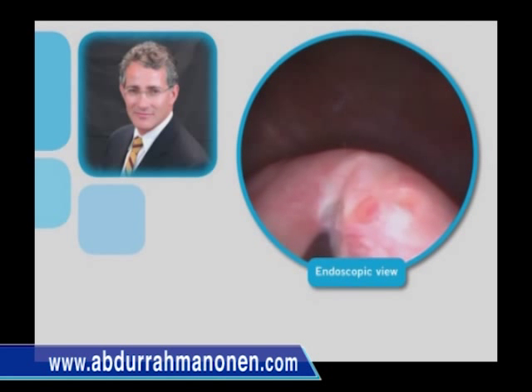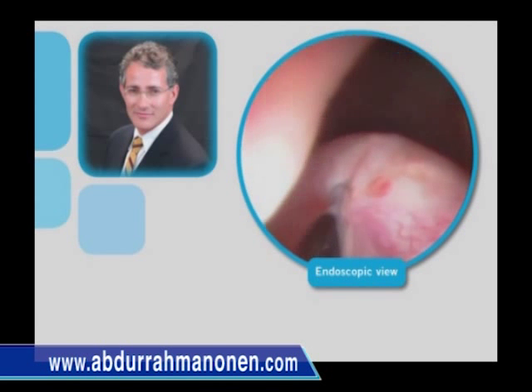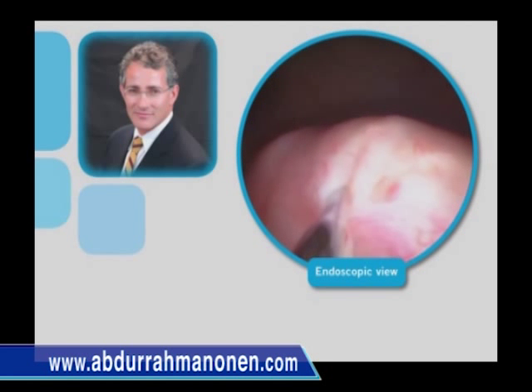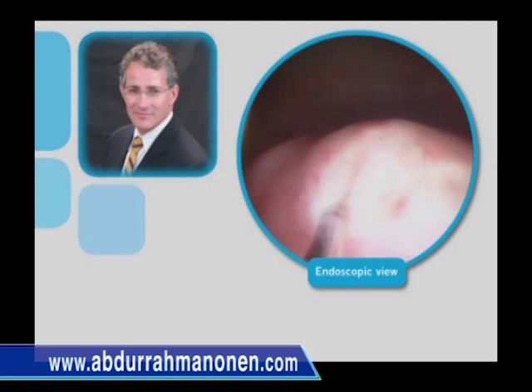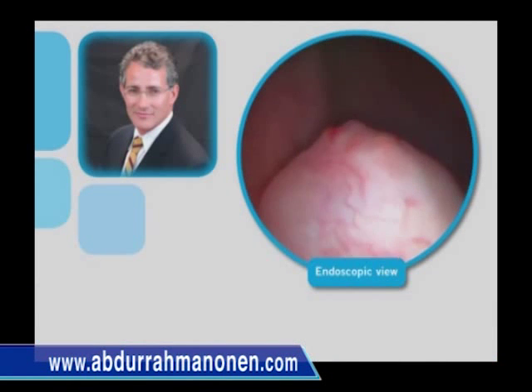The surgeon will feel very subtle changes in the pressure buildup as injection proceeds, and these will also provide subtle clues for the end point of injection. Pulling the cystoscope back to the bladder neck will help identify improper technique, in that the deflux will be noted to move caudally and therefore out of the field.